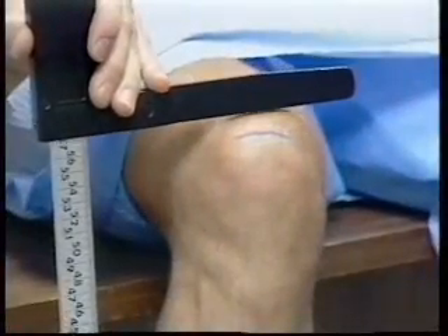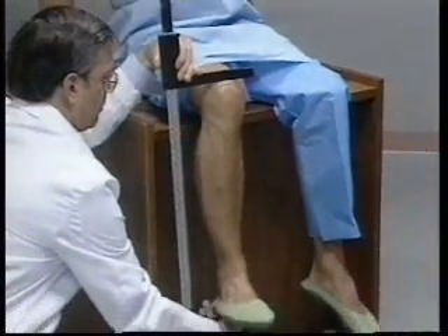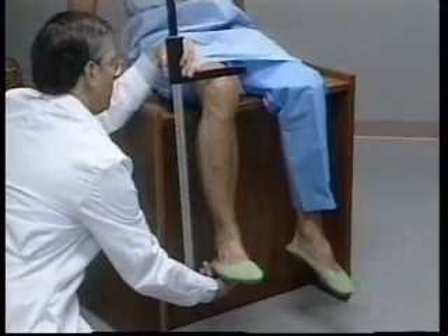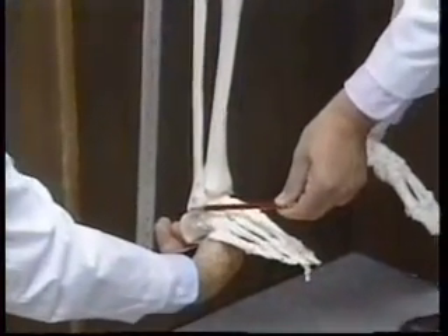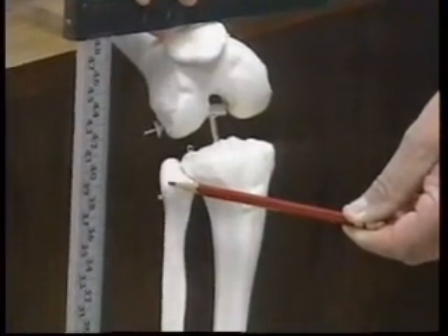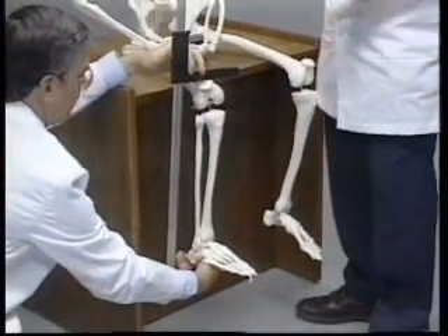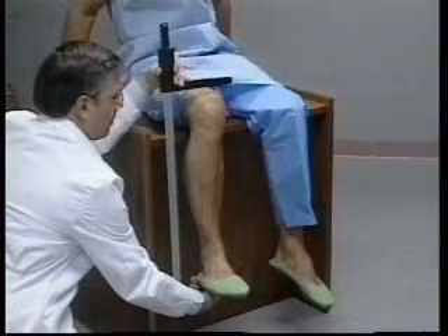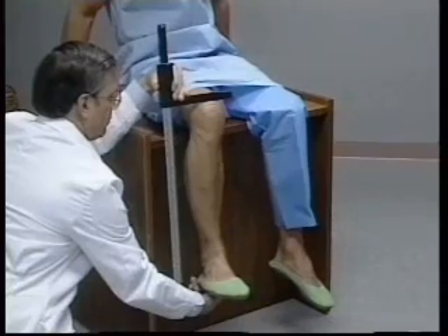The movable blade of the caliper is placed on the anterior surface of the right thigh above the condyles of the femur, approximately three to four centimeters proximal to the line previously marked on the upper border of the patella. The shaft of the caliper is held parallel to the shaft of the tibia. The caliper shaft passes over the lateral malleolus of the fibula at the ankle and just posterior to the head of the fibula at the knee. Firm but gentle pressure is applied to the caliper blades to compress the soft tissues on the heel and thigh. The reading is recorded in centimeters to the nearest millimeter.